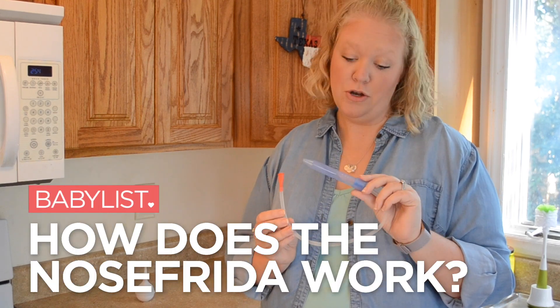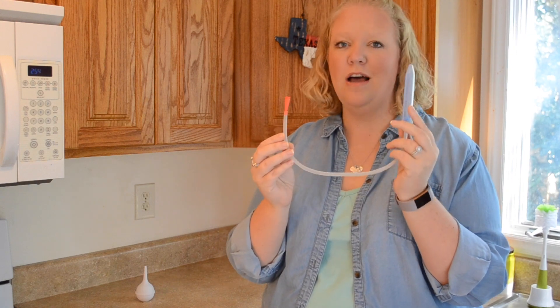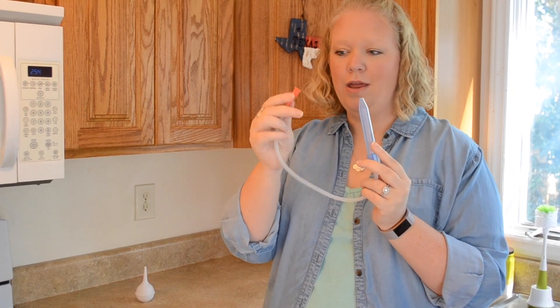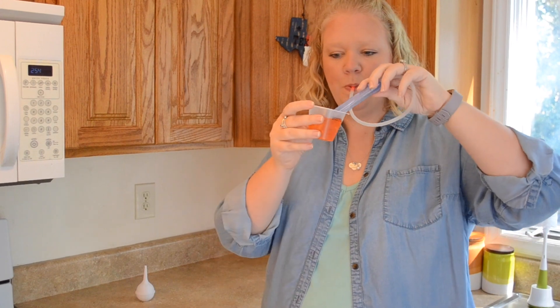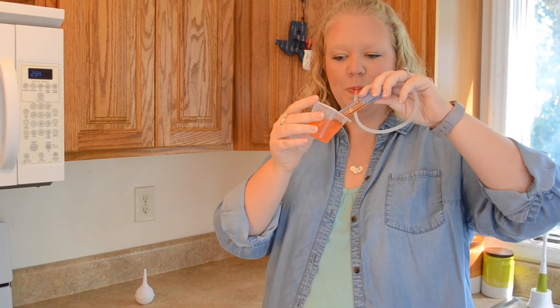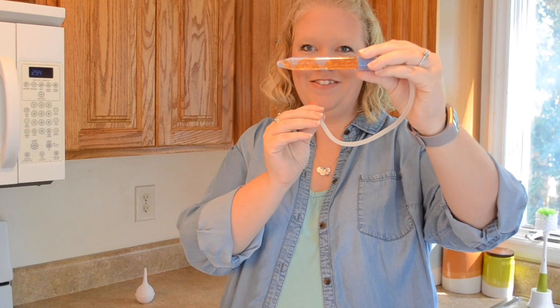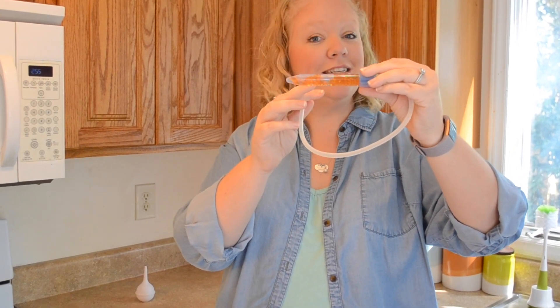If you've never seen the NoseFrida before, you're probably wondering how this works. This is the end that you're going to stick in your child's nose, and this red part is going to go in your mouth, and then you're going to suck like this. As you can see from the jello that I have now sucked up into the NoseFrida, this is how it's going to suck up the boogies out of your little one's nose.